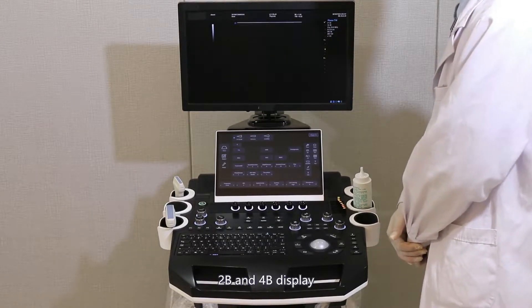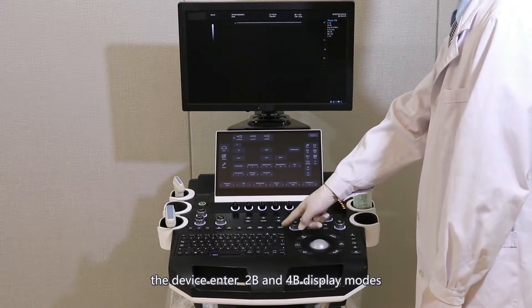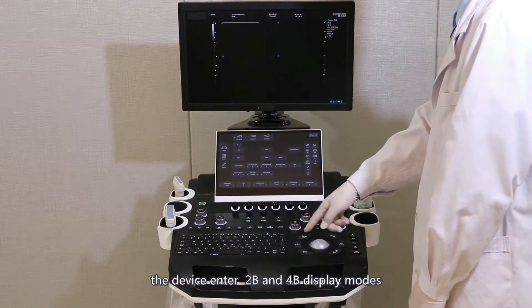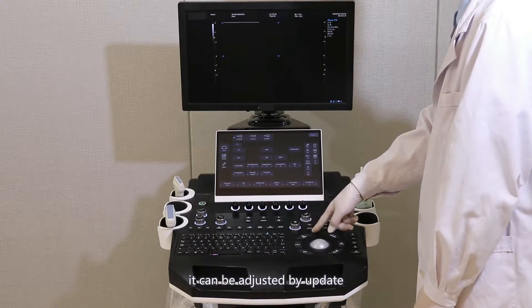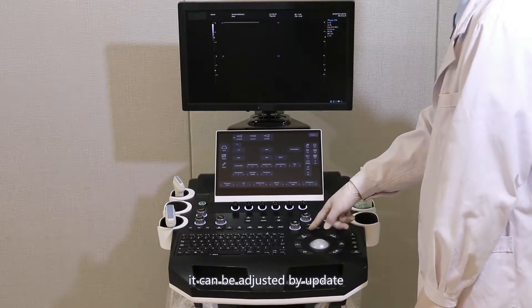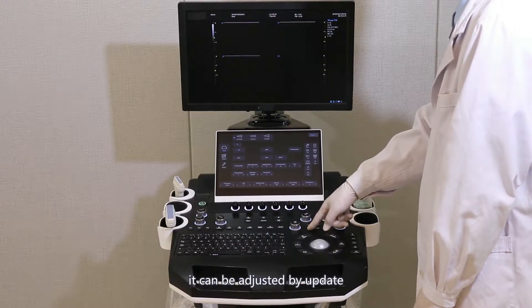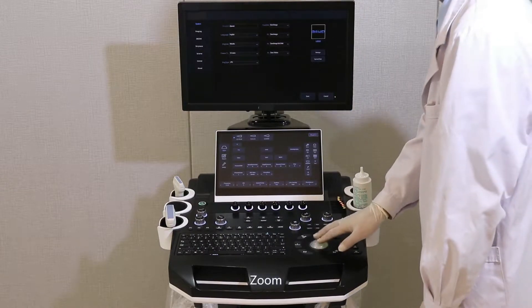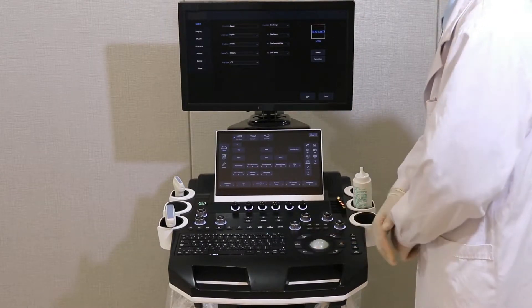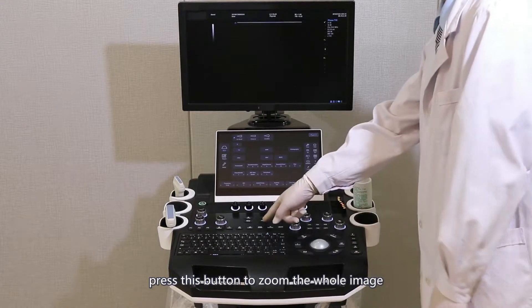2B and 4B display: the device enters 2B and 4B display modes, which can be adjusted by update. Zoom: press this button to zoom the whole image.